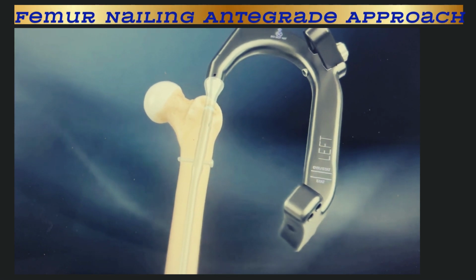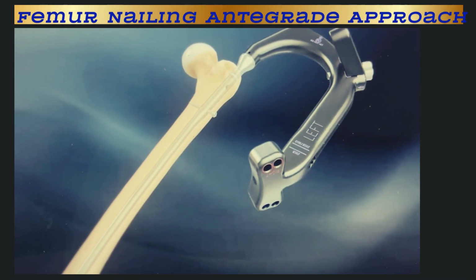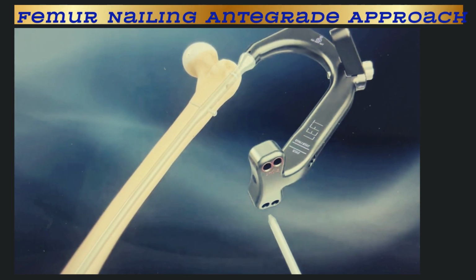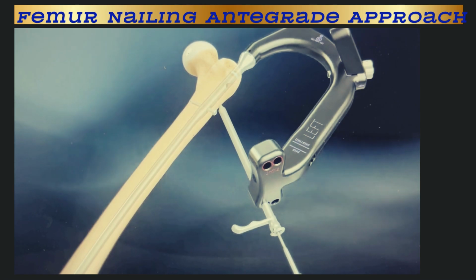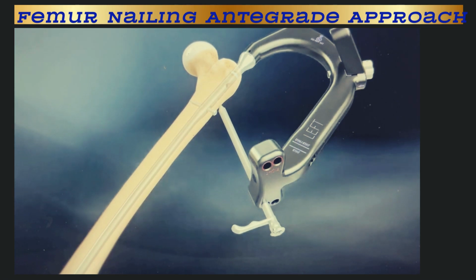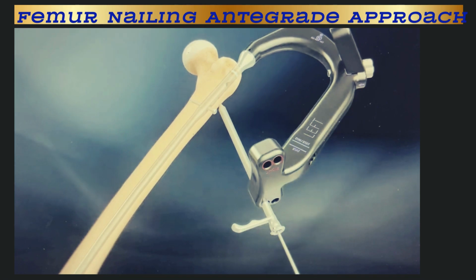For proximal targeting, reconstruction interlocking, insert the screw sheath, the drill guide, and the obturator through the targeting module and mark the incision location on the skin. Make a small incision and insert the sheath, drill, and obturator until it contacts the cortex of the femur.